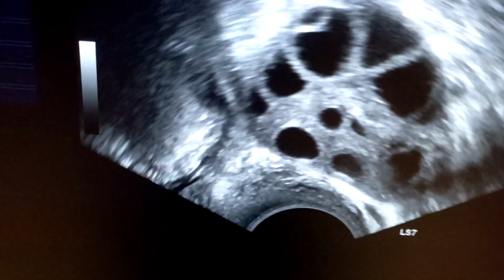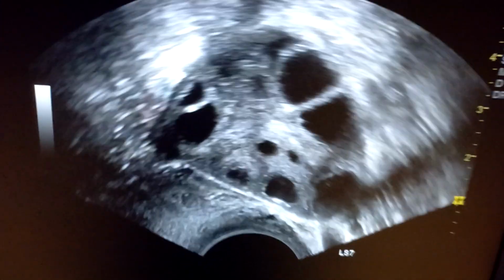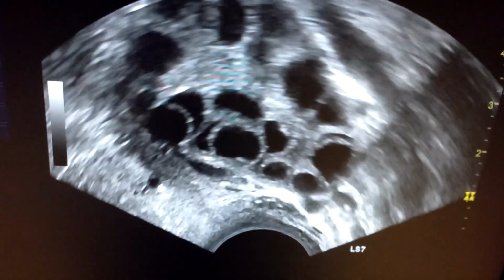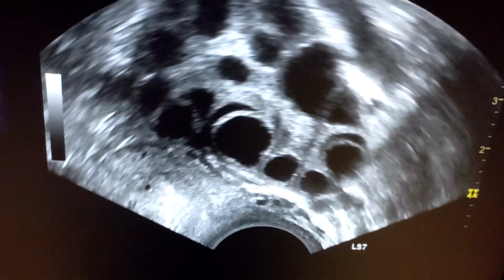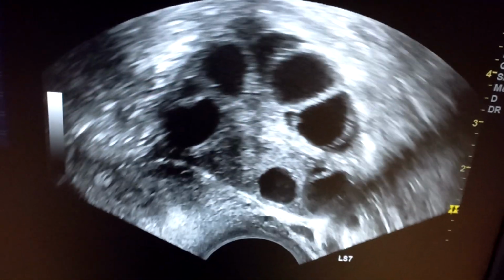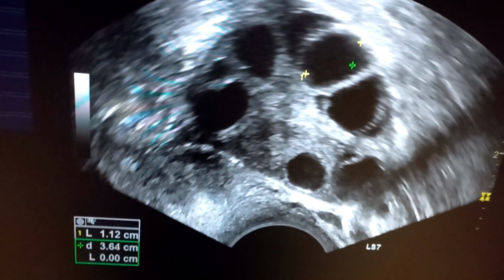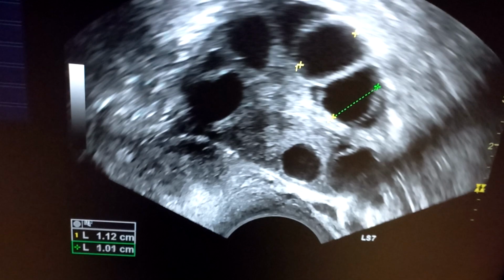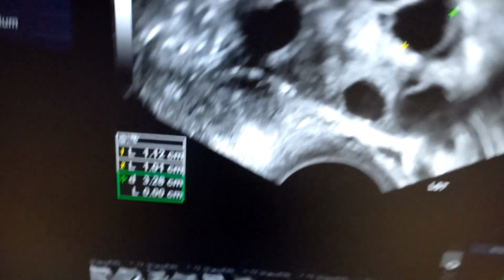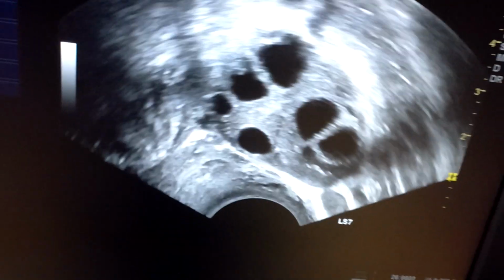This is the larger ovary, the left ovary of the patient. This has close to 20 balls, that is 20-25 follicles, and you can see the majority of them are of the same size. I'll just demonstrate by measuring this. Again we have a small measurement over here, and here is the measurement that you can see. It's almost 10-11 millimeter in size. So this is a very even cohort.